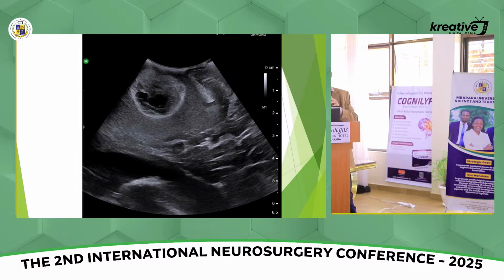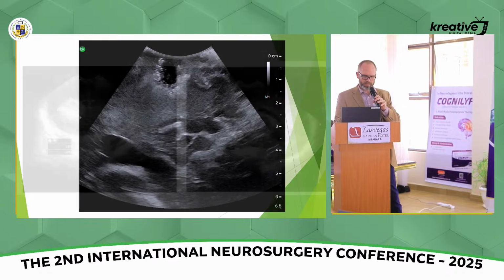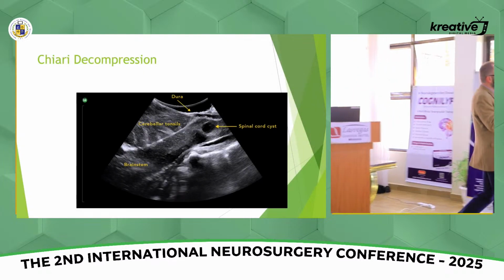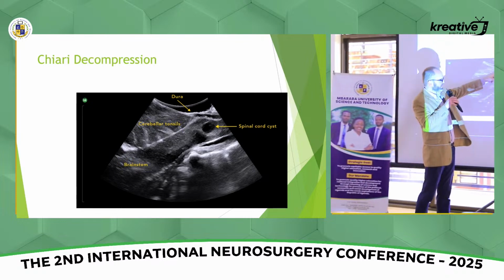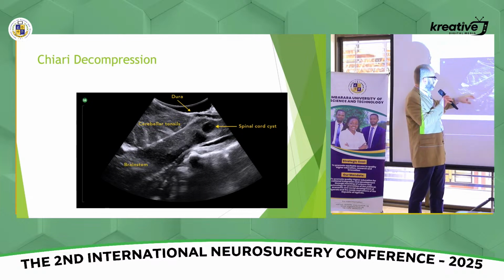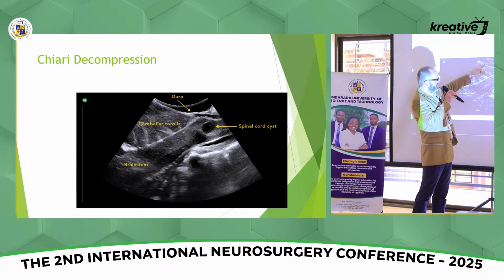Okay, this is another brain abscess case, and this is a Chiari case, so Chiari decompression. You can appreciate the cerebellar tonsils here, and the upper cervical syrinx. This is the brainstem and the spinal cord, and this is the dura.